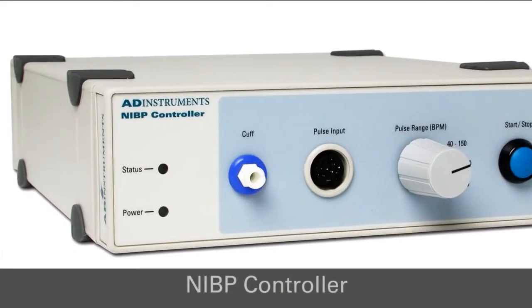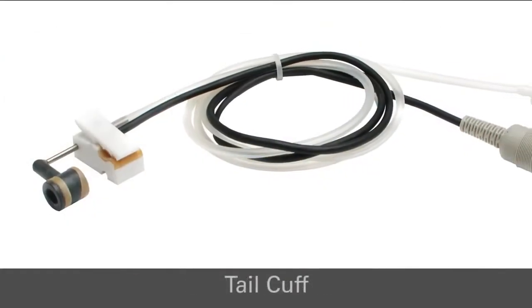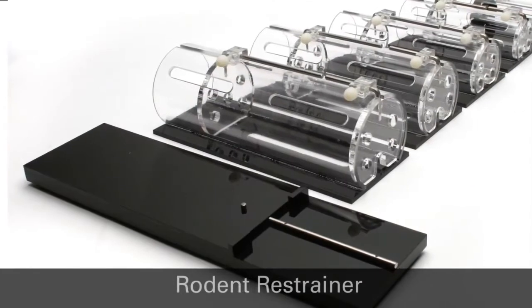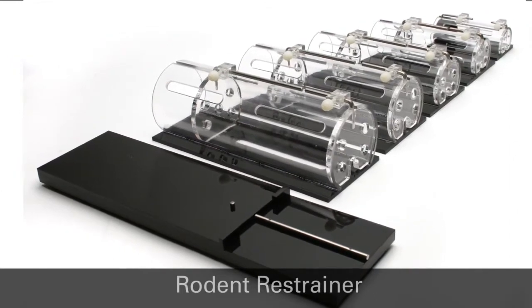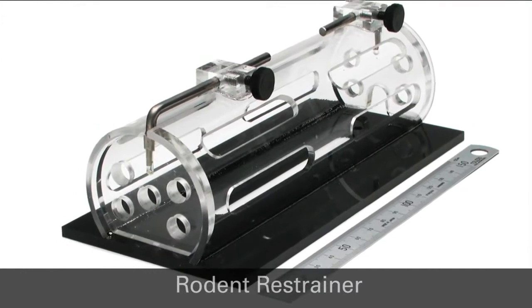The two main components of this system are the NIBP controller and a tail cuff for either mice or rats. This training video demonstrates the correct use of this equipment and includes a live demonstration of non-invasive blood pressure recording from a rat.